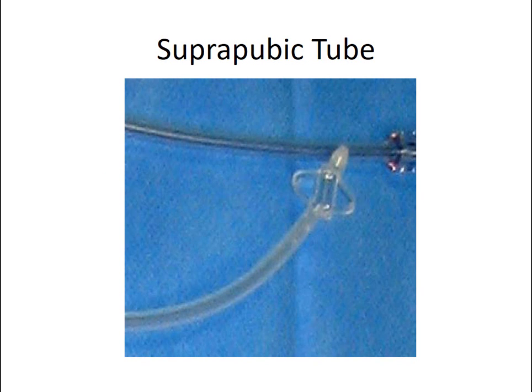This is a different type of catheter, a suprapubic tube. This is not passed per urethra into the bladder. Rather, in some of these children who have had complex repairs, such as bladder augmentations, where we want every chance of excellent drainage, particularly when we look at that the Foley catheter has a small lumen, we get concerned if we put a piece of intestine into the urinary tract, when we use it as a patch and it can produce mucus, that it could plug that small lumen.